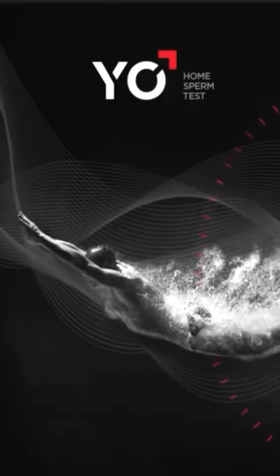Welcome to How YO Works. Watch this demo to learn how to use YO before you run your YO test.